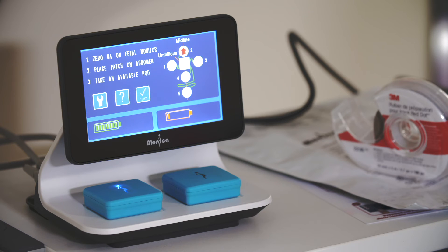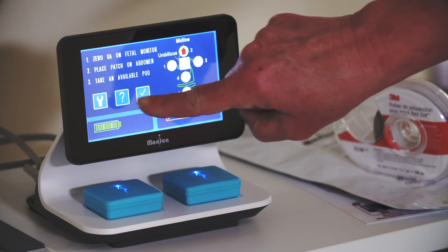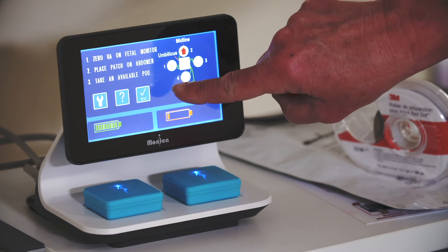Above the battery icons are three buttons: a wrench icon providing access to the setup menu, a question mark icon to access help, and a button labeled test.